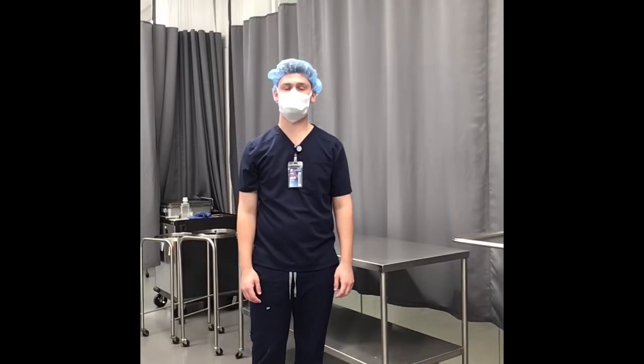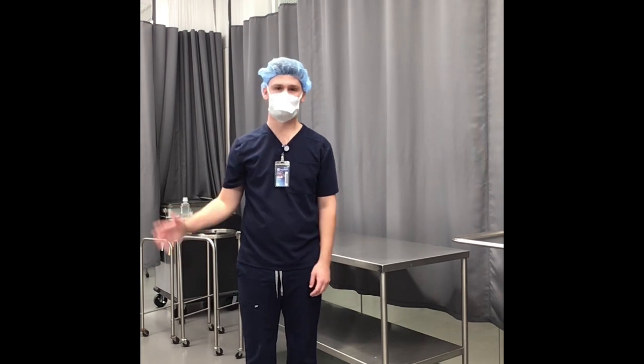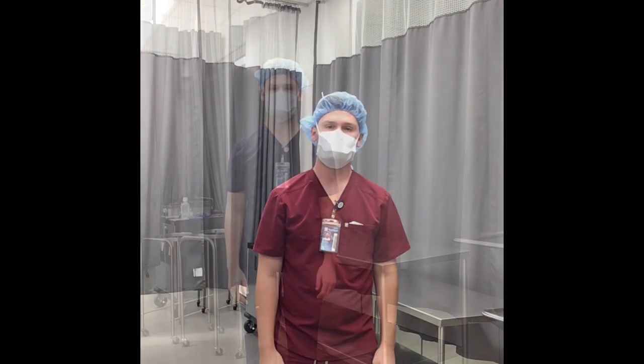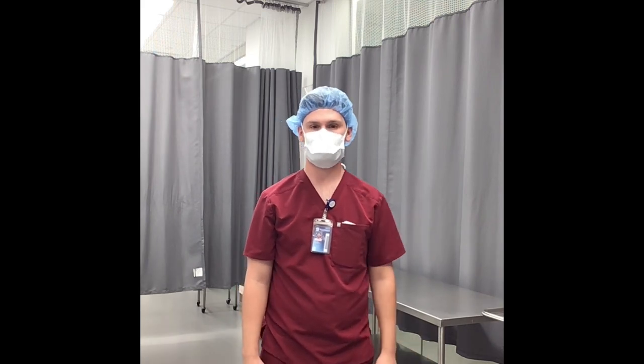Hi everybody, I'm going to be demonstrating sitting around the room, so just basically going through my case card and opening up my sterile field for both Competency Assessment 1 and Competency Assessment 2 Laparotomy. In Competency Assessment 1, you'll have 30 minutes from the time you open your back table to the time you break out of your gown.